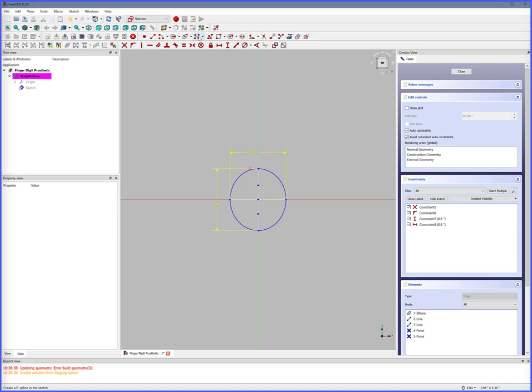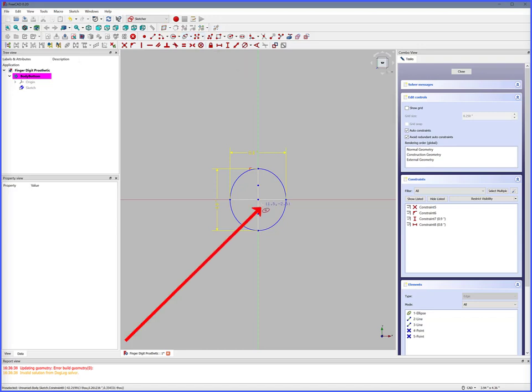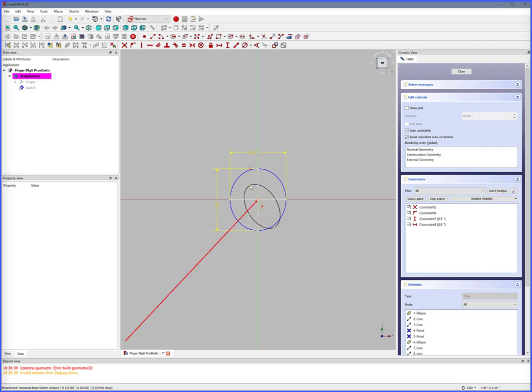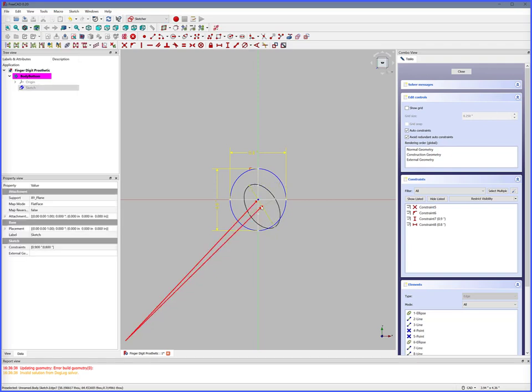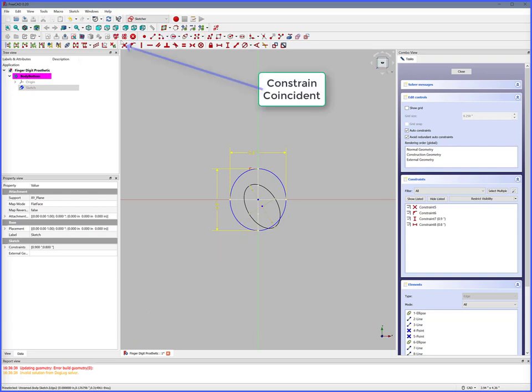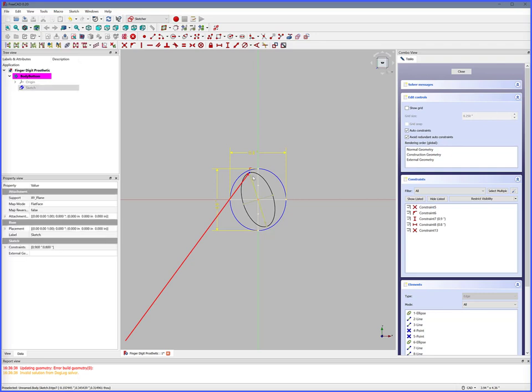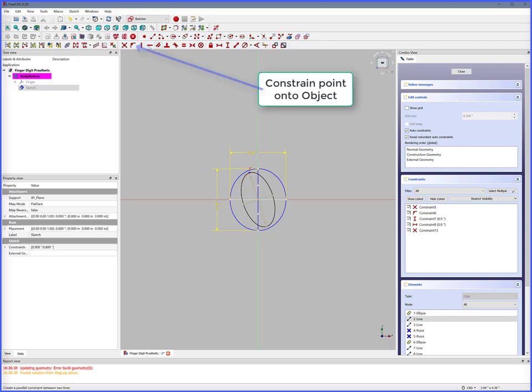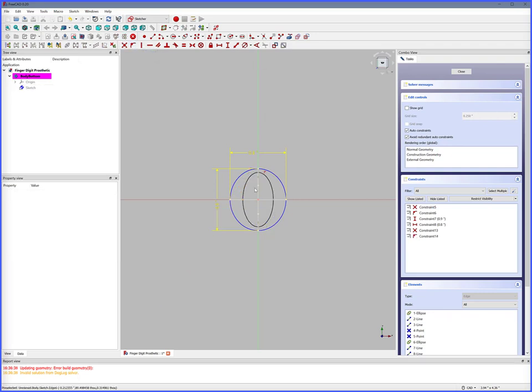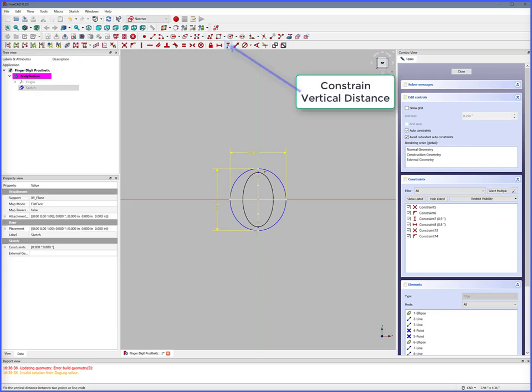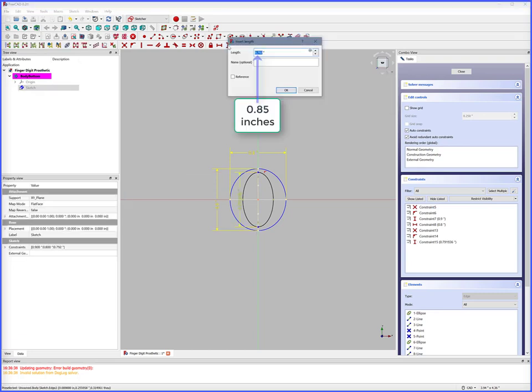Next we'll create the cylinder inside dimensions. Ellipse by center, click, double click to complete, right click to release. Select the XY center, select center of ellipse, Constrain Coincident — centered. Select ellipse point, select Y axis, Constrain Point Onto Object — now it is symmetrical. Select Y max points, Constrain Vertical Distance.